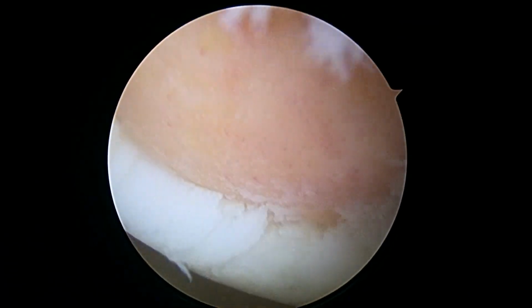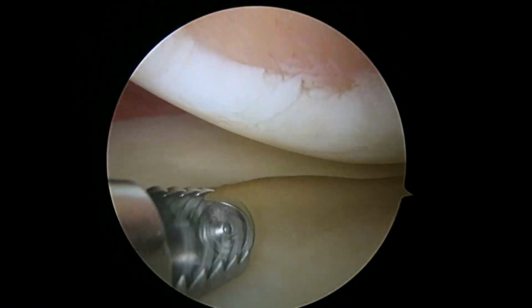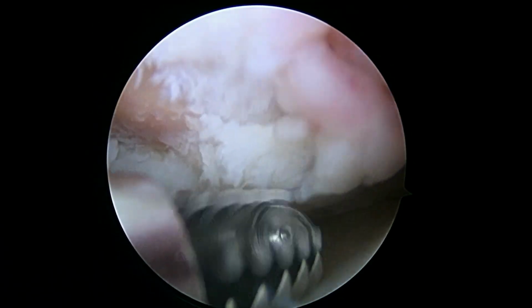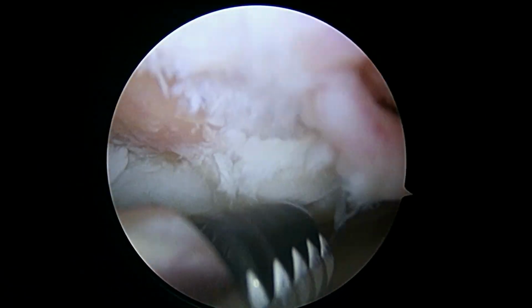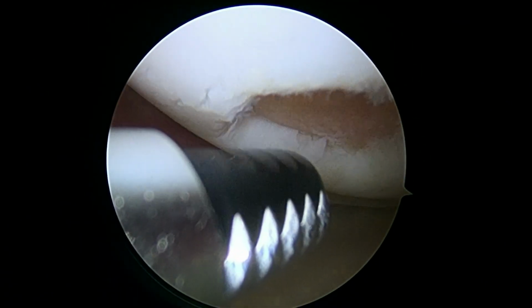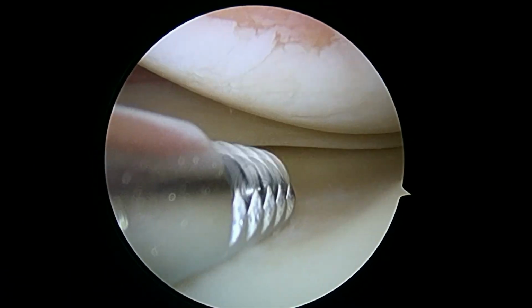The defect actually was hinged, so it didn't look like a defect very much on imaging. But clearly unstable and clearly not okay to just leave. And so more than likely, with what we have available today, we're going to be microfracturing that. The camera here, please.